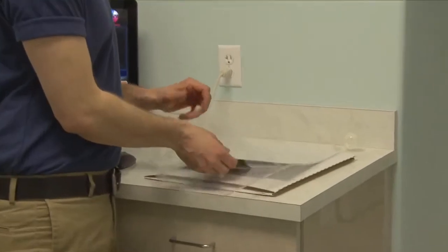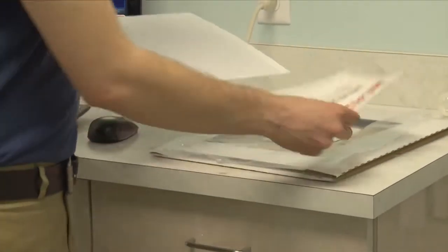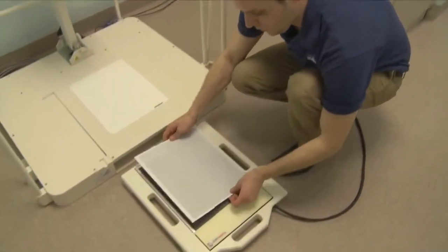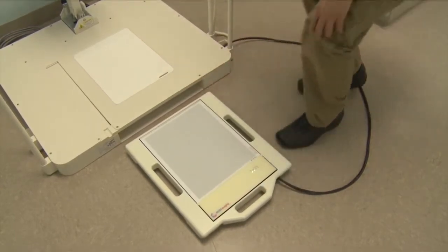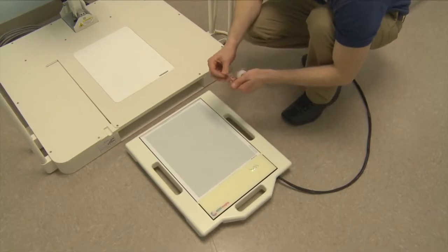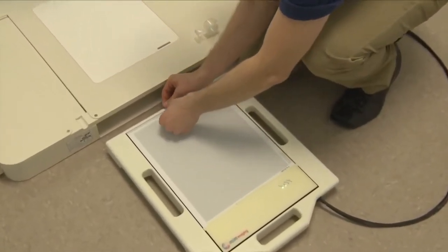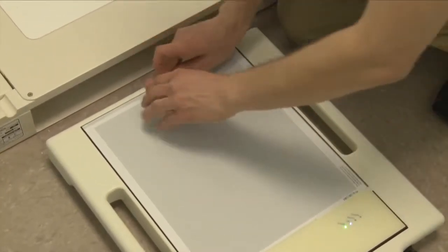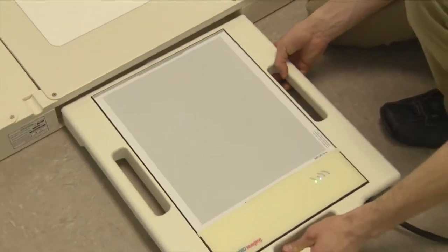Carefully take the calibration grid out of the plastic and place it onto the panel to align the bottom notch. Place a small piece of tape right at the top to hold the calibration grid to the panel, not to cover any of the holes. This is necessary so the calibration grid does not move while we slide it underneath the base.